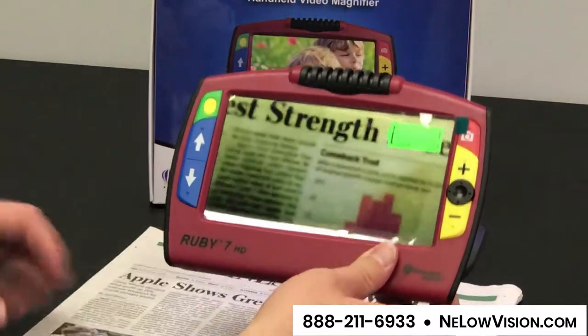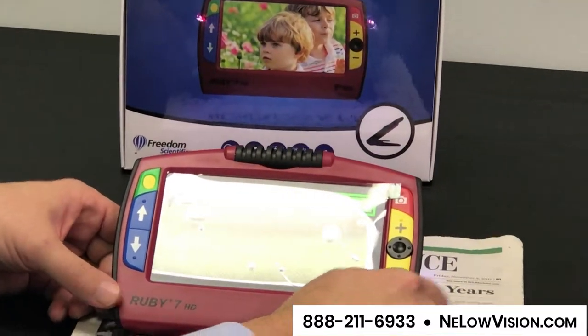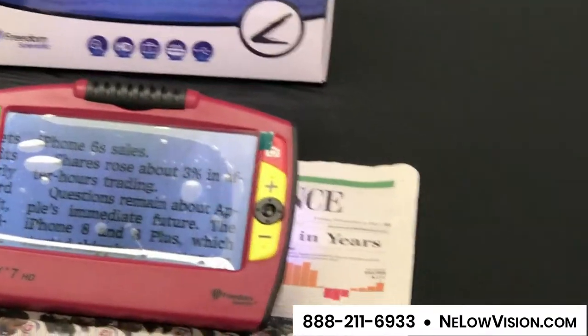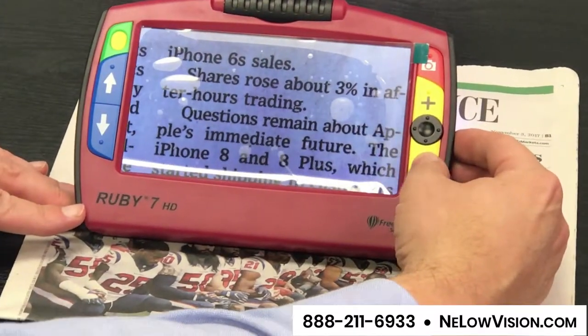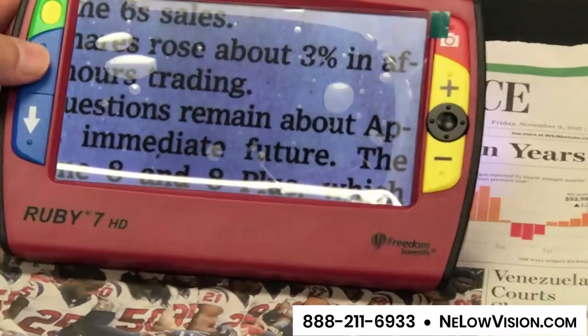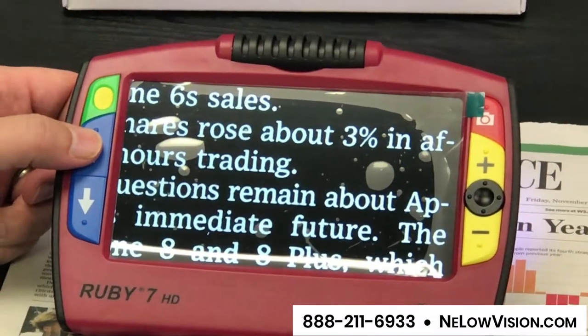I'm going to place the device down on some text. With all the video magnifiers from Freedom Scientific, you have the ability to increase or decrease the magnification. You also have the ability to change the contrast mode — you can go to any one of multiple colors with different contrasts.